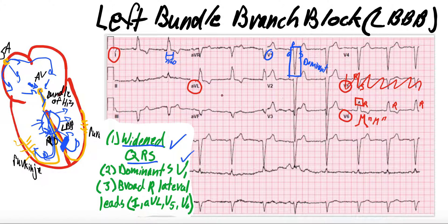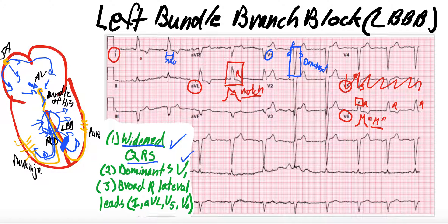In AVL, we have this big broad R wave, and if you look closely it comes up, goes down, and has a little thing that comes up again. We call this just notching — not M notching, but another type of notching pattern we see in left bundle branch blocks. Similarly in lead 1, we see our R wave: P, then Q, then we go up into our R, it comes down, we get a little notch, and then it comes down the rest of the way.